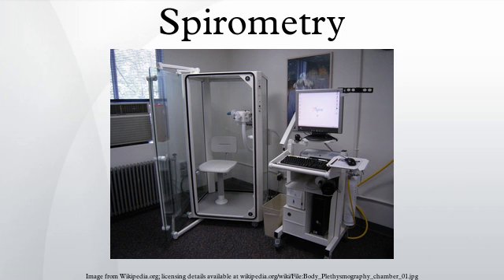FEV1/FVC ratio. FEV1/FVC is the ratio of FEV1 to FVC. In healthy adults this should be approximately 75–80%. In obstructive diseases FEV1 is diminished because of increased airway resistance to expiratory flow.